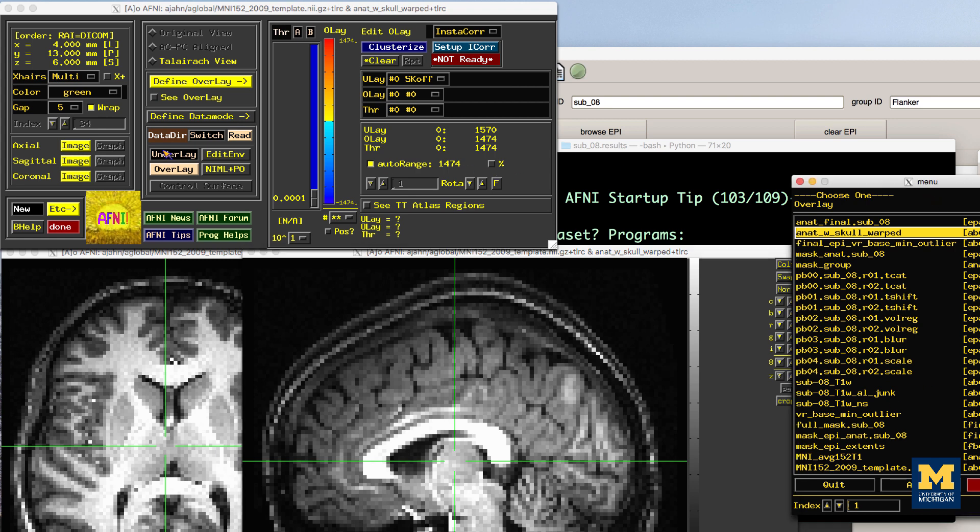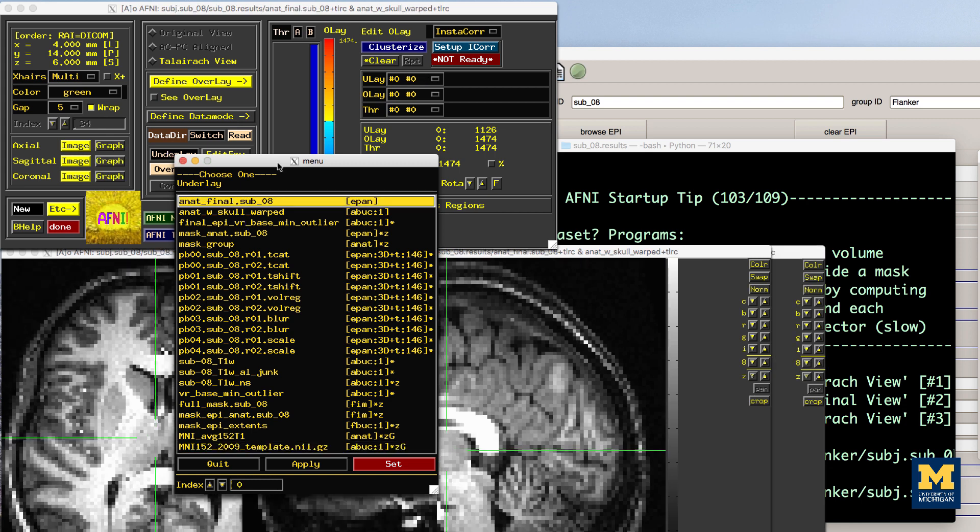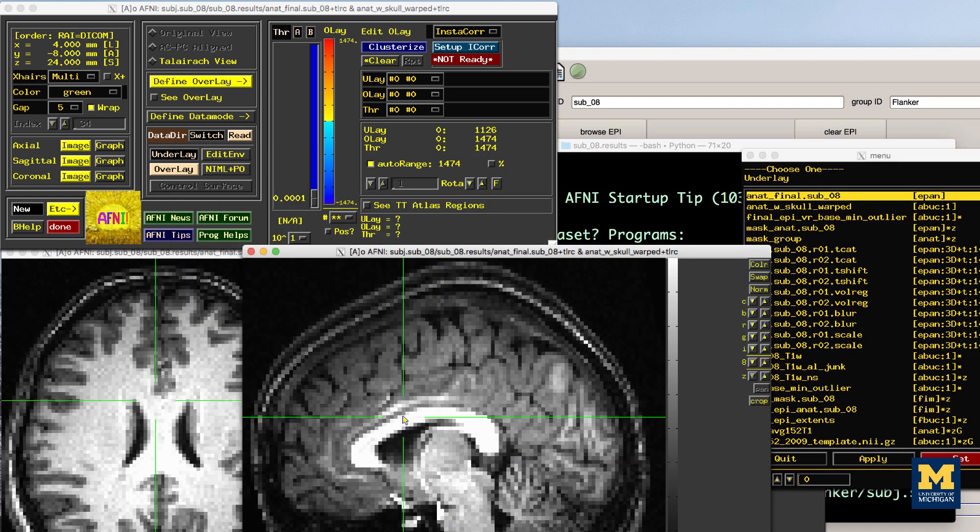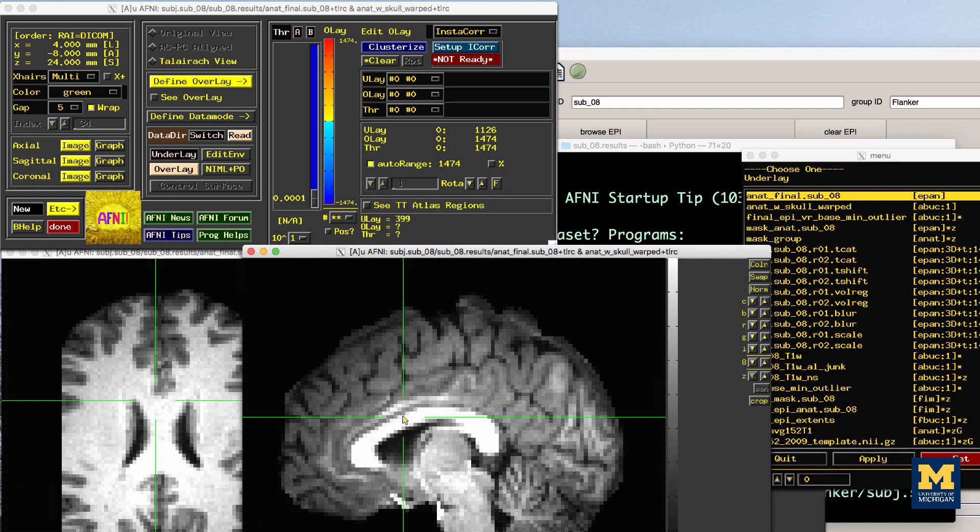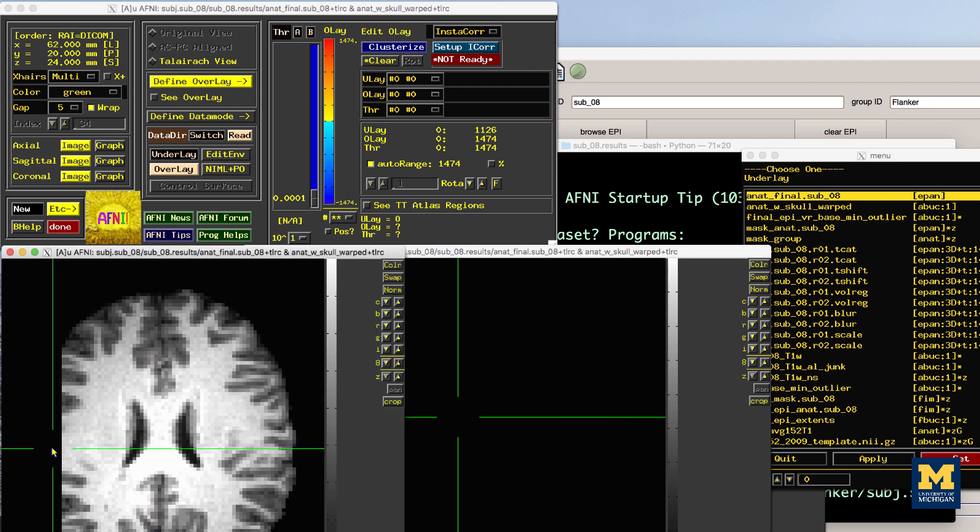Now we've found the source of the error. Part of the brain on the left has been removed during normalization. But how do we fix this?